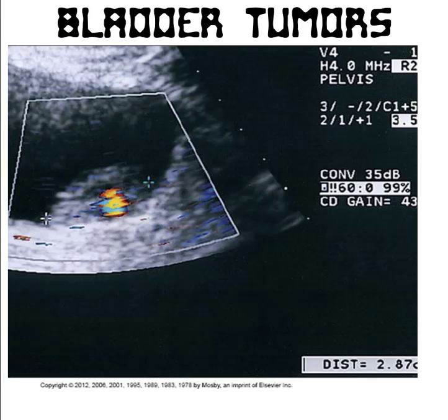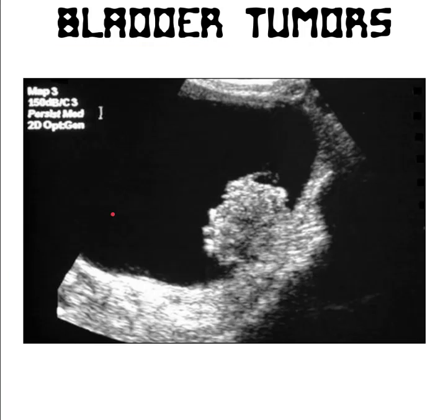So here's an example of a bladder tumor. We have the urine in the bladder here, the bladder wall, and off to the side here we're seeing this focal thickening of the bladder wall. This one happens to have some color flow within it. Here's another example. I would say this is probably the more common appearance of transitional cell carcinoma. It's just this hunky, irregular shaped structure just hanging off the side of the bladder.